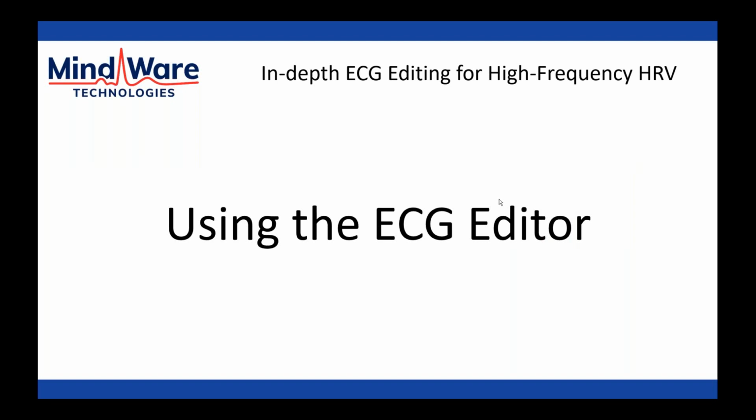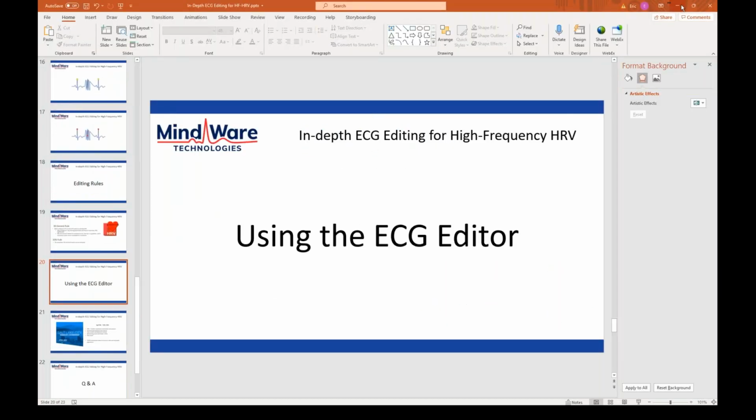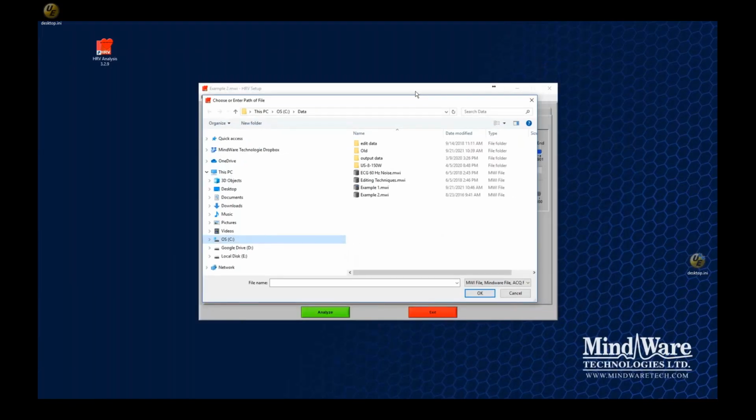All right, with that, we're going to get into the actual application. We're going to walk through some examples of the editing techniques that I just mentioned. We'll talk about filters and all those things. So I'm going to close the PowerPoint presentation and show my application.